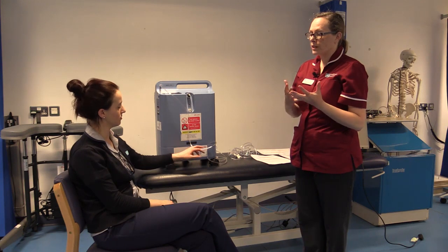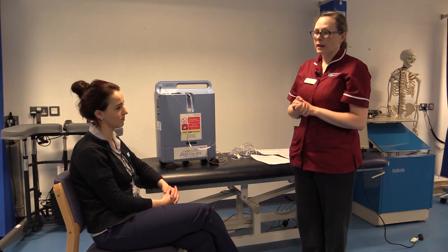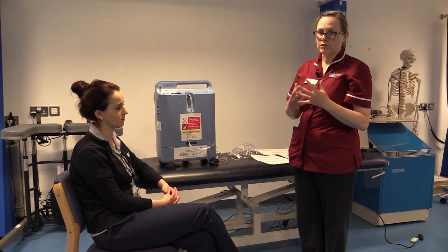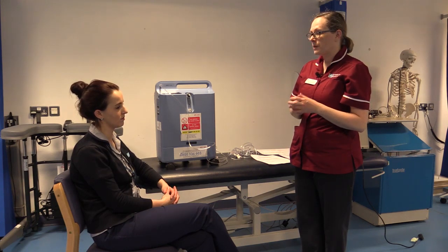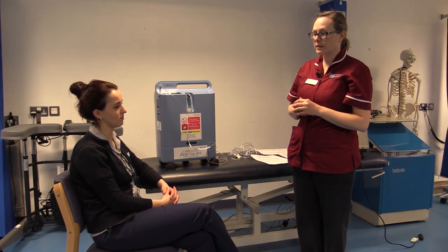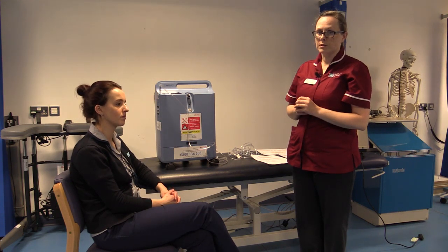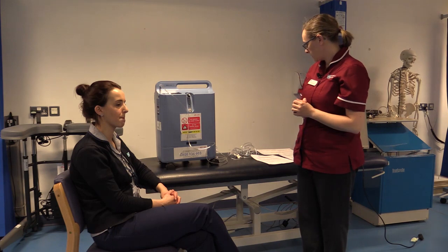If you have moisturiser on your hands, you should wash them before you handle the oxygen equipment. Alcohol gel, as long as your hands have dried, that is fine. If the patient's nose is dry or the lips, they cannot use Vaseline under any circumstances. They must purchase some KY jelly through their chemist. If their nose is broken, the doctor can prescribe an appropriate treatment for that.